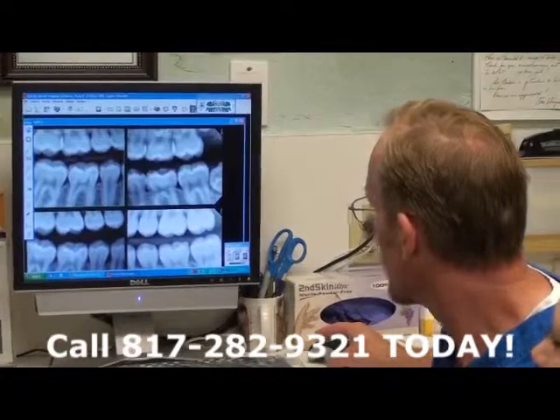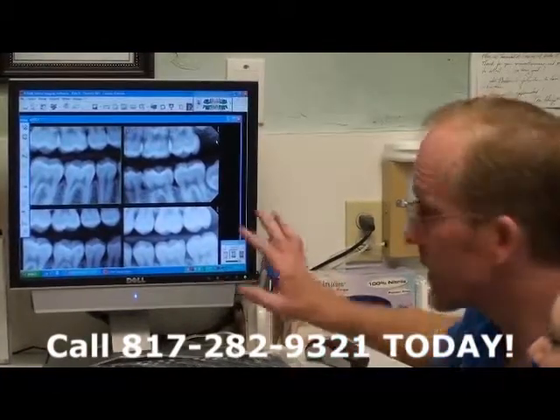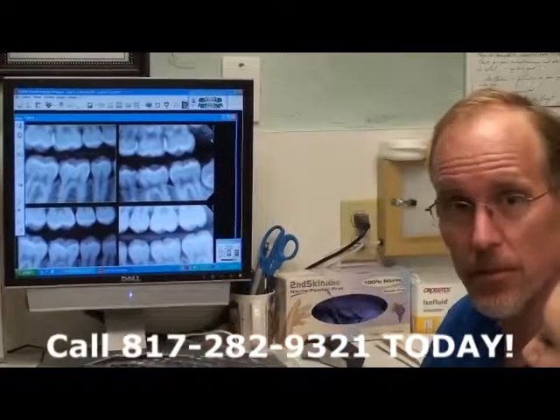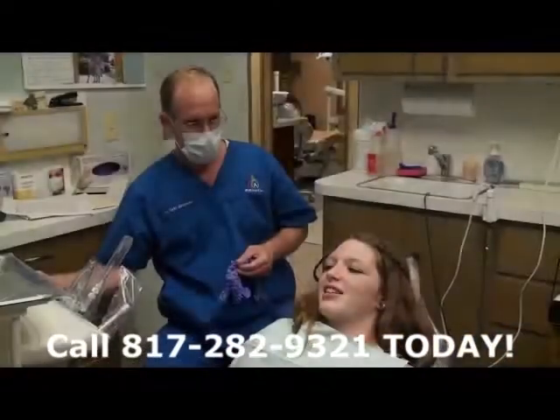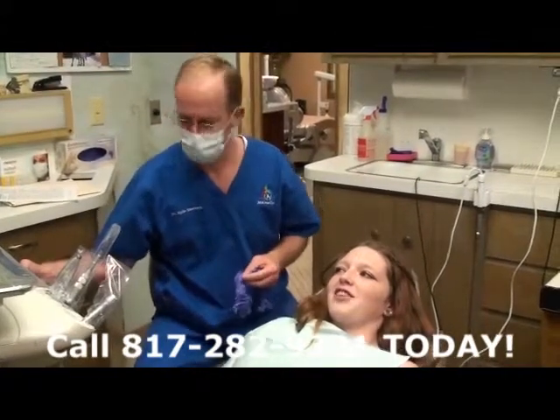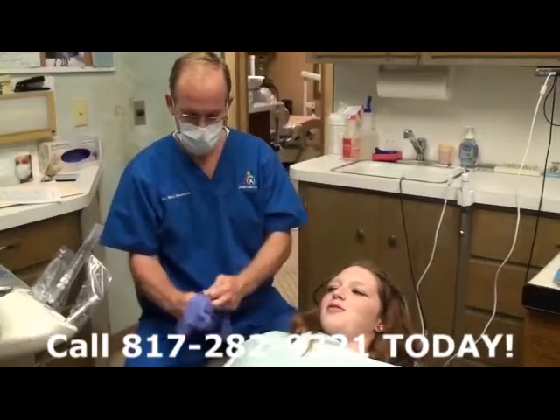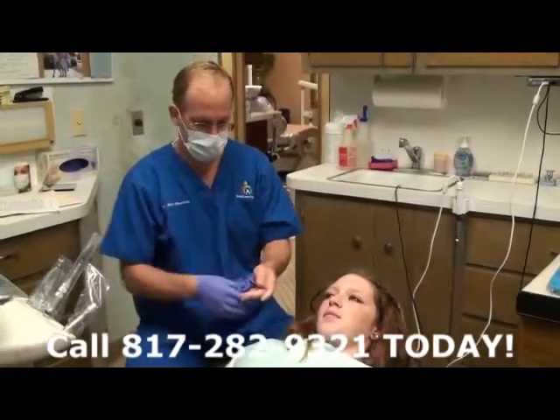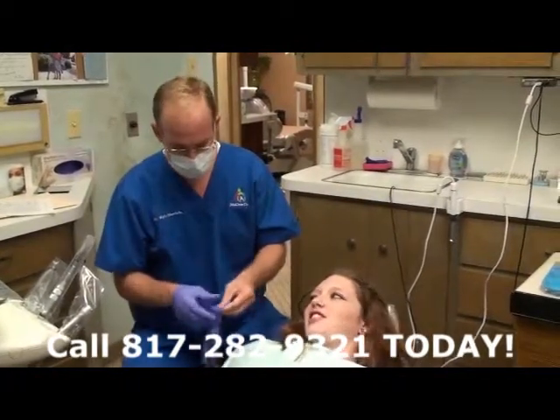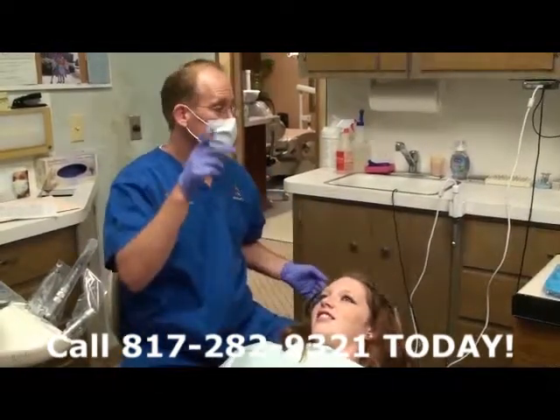So now I'm going to take a look in our mouth here and see if what we see on the x-ray is similar to what we see in the mouth. Okay, Miss Hannah, let's take a look here. How old are you, Anna? 15? 16. 16? Let me get that last one.